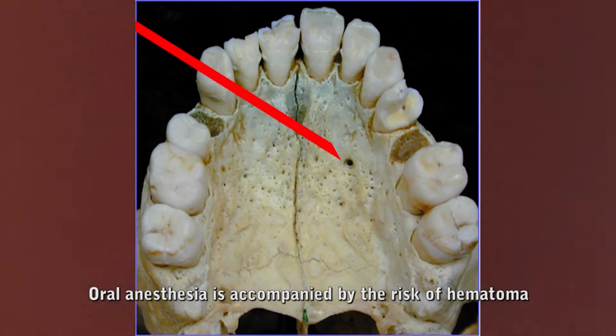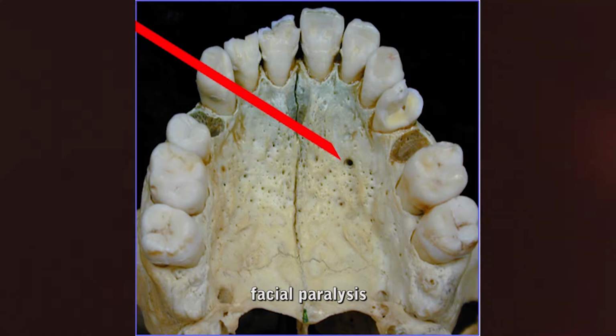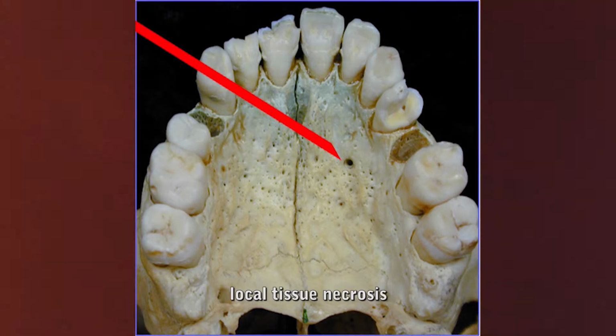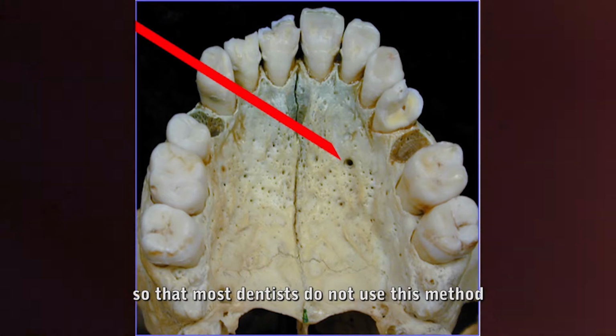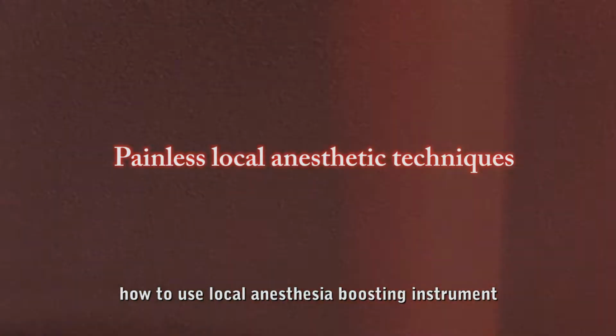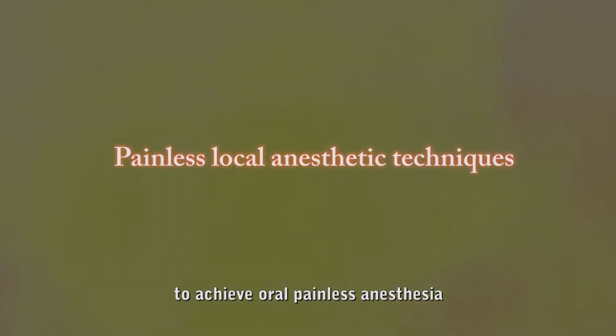Oral anesthesia is accompanied by the risks of hematoma, injection area pain, facial paralysis, infection, nerve injury, and local tissue necrosis, so most dentists do not use this method. Now let me introduce how to use the local anesthesia boosting instrument to achieve oral painless anesthesia.